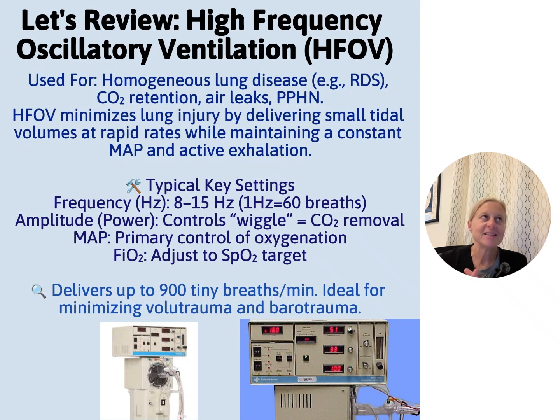It is unique because the high frequency oscillating ventilator is trying to minimize lung injury by delivering those small tidal volumes at rapid rates, but has active exhalation. Even if you watch a water bubble bounce in your circuit, you will see it going in and out, in and out.